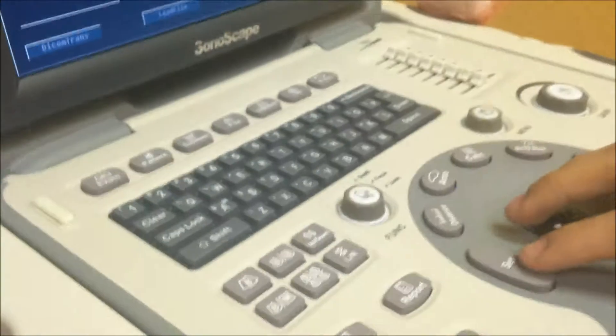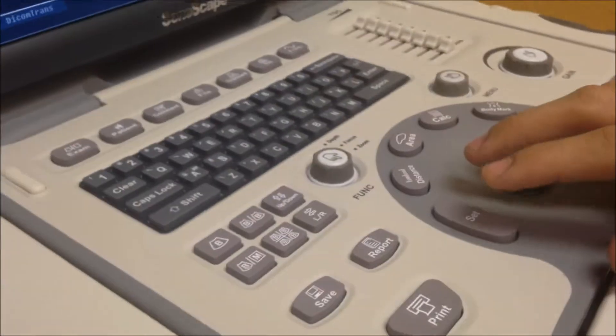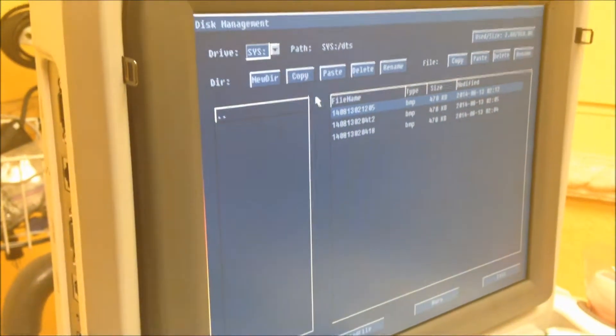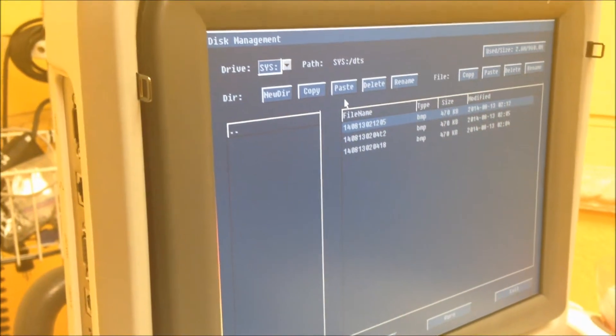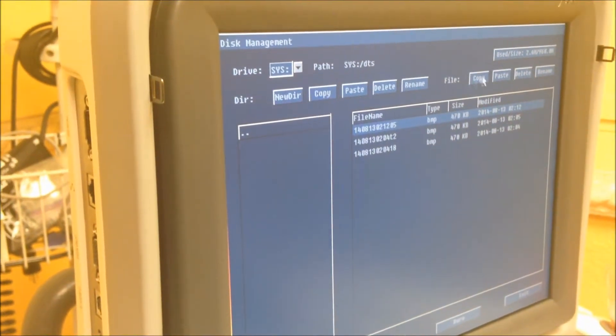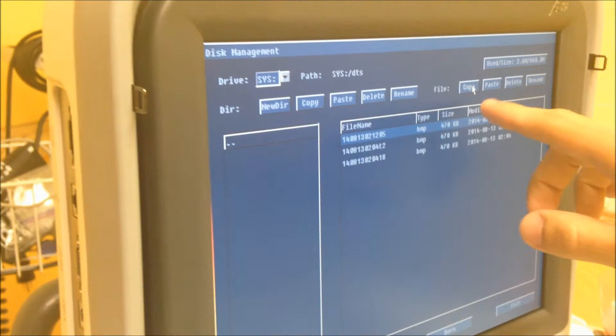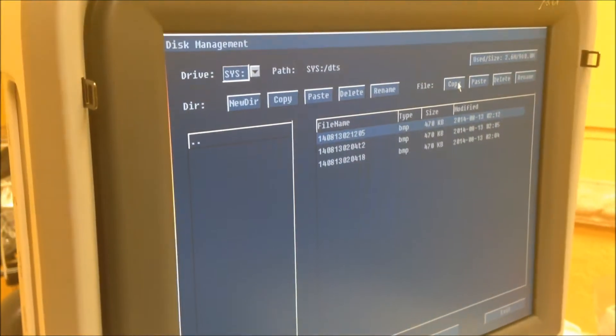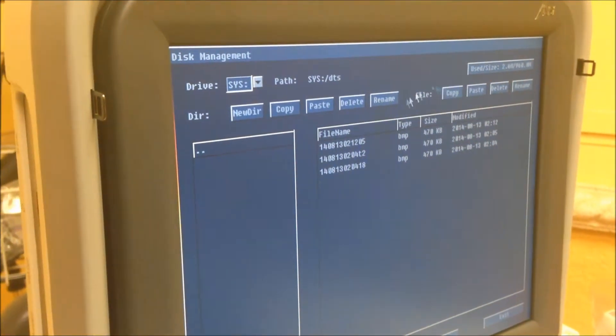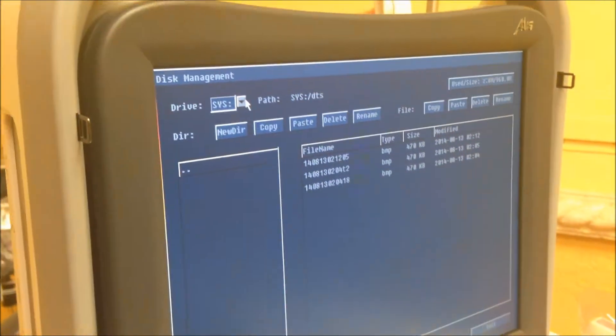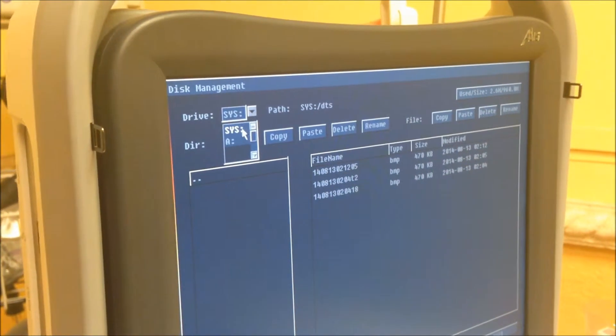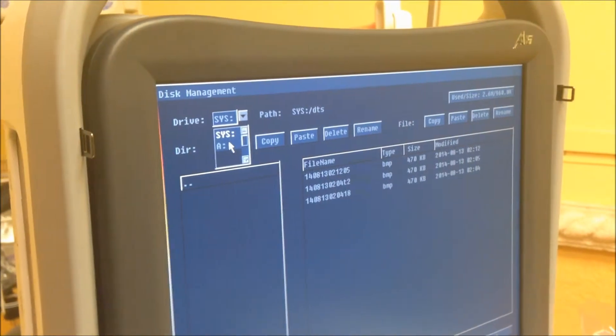So this is very simple. All you do is come over here and you click on the picture. And you copy file, copy. And then you come over here to drive. Click on that and go to A.